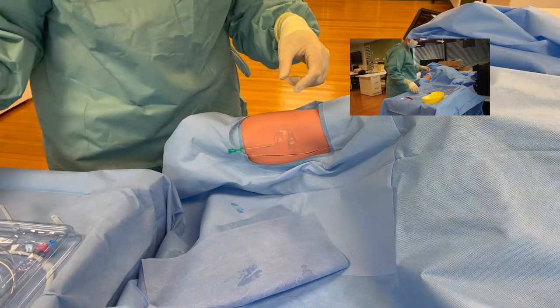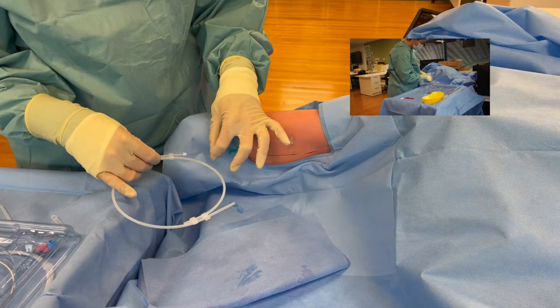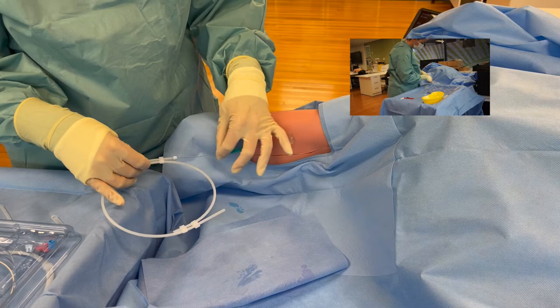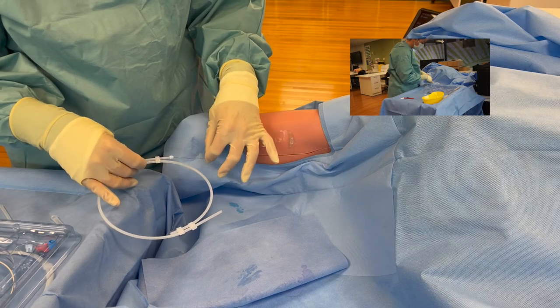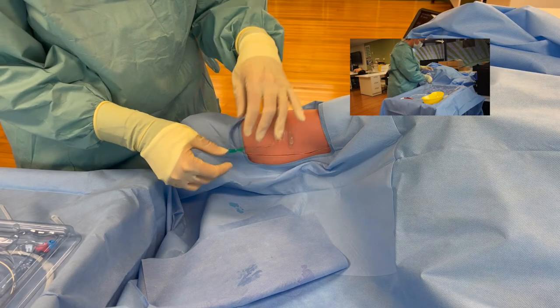At this point I'm going to take my guide wire and thread that - it should go smooth up the wire. Please excuse this bent wire, it has been used before.